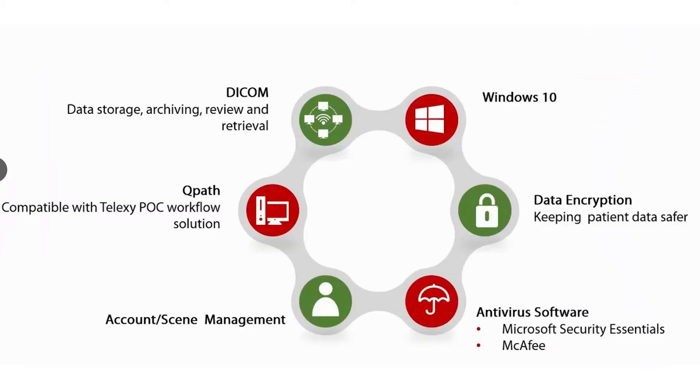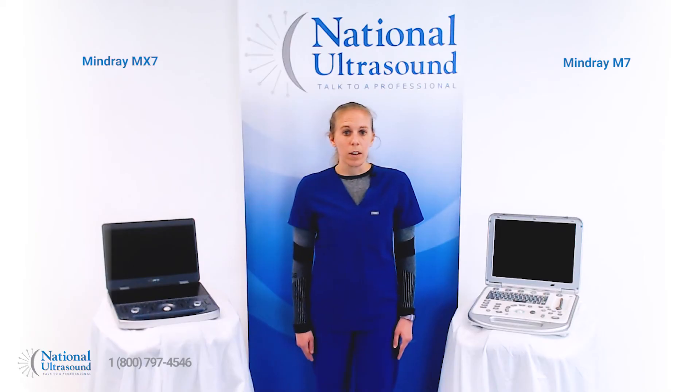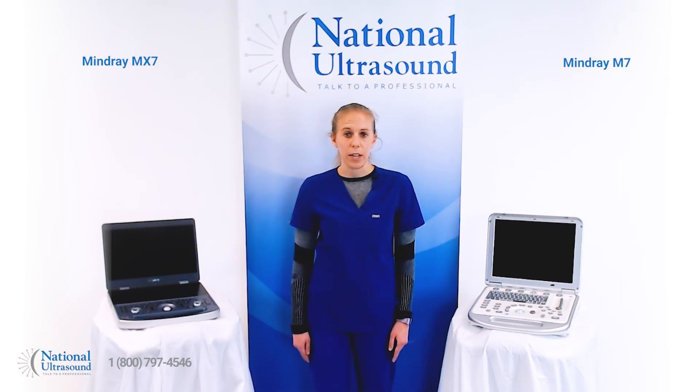Other new system technology includes a Windows 10 operating system and antivirus software for increased security and data encryption. The MX7 is the first MindRay portable system powered by ZST Plus, zone sonography technology.